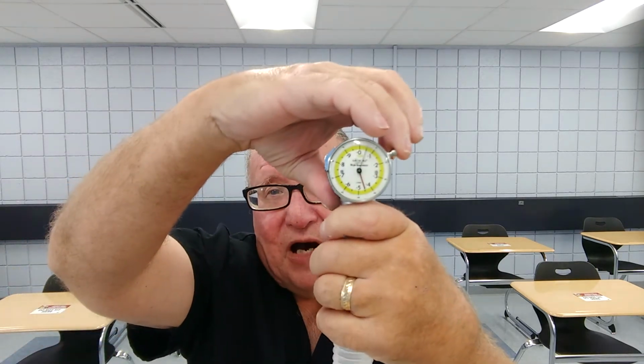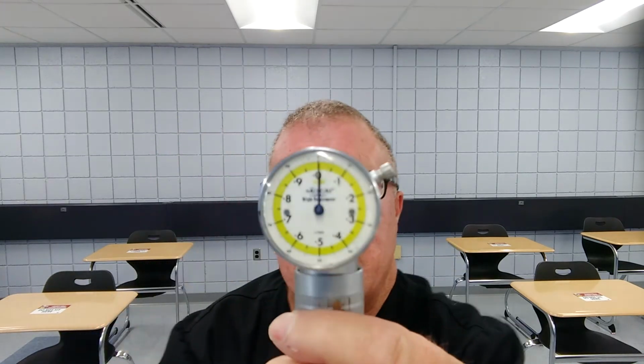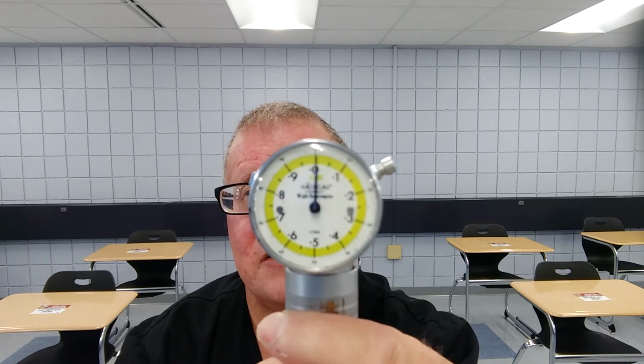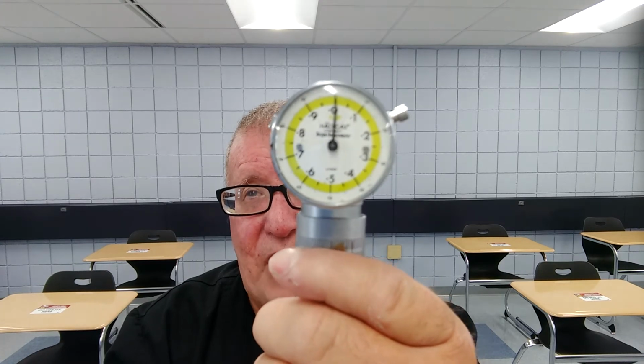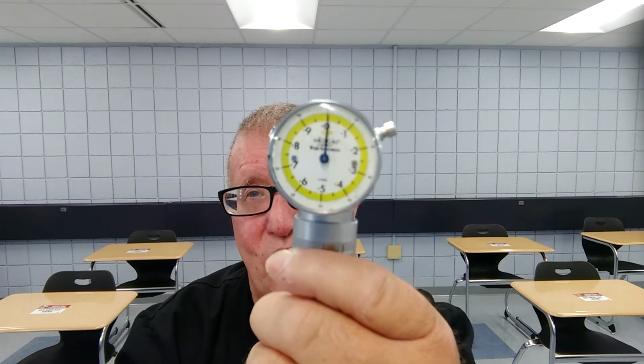Again, I'm going to make sure this is on. I'm going to hit this button. It's going to reset to 0. Now with this one, again, it takes a lot of practice with the patient. You got to really explain to them how to do it. You tell the patient they need to breathe in as much air as they can. For you guys, it's considered total lung capacity, and then you're going to have them blow out slowly till they can't get any more air out.